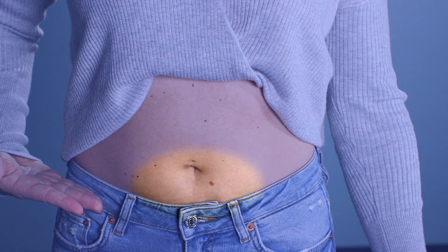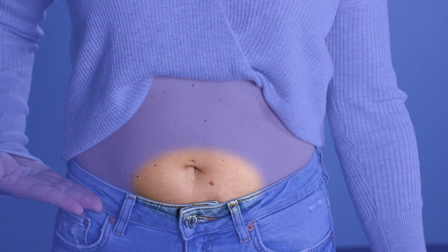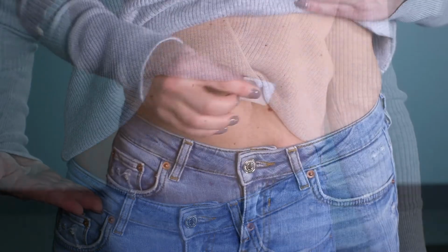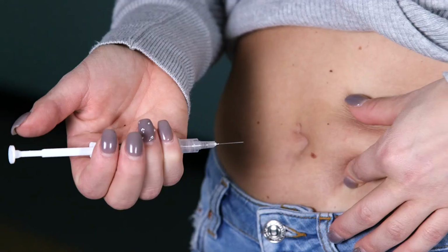The most common site is the abdomen, using the left, right, or below the belly button, staying approximately 1 to 2 inches away from the belly button. You can also use the back part of the upper arm or the outer aspect of the upper thigh. Alcohol wipe the area and allow to dry.